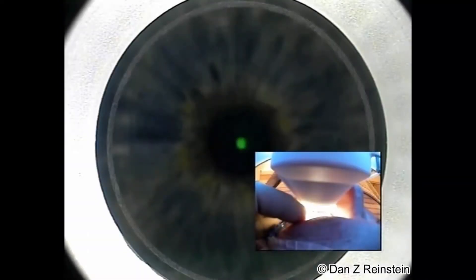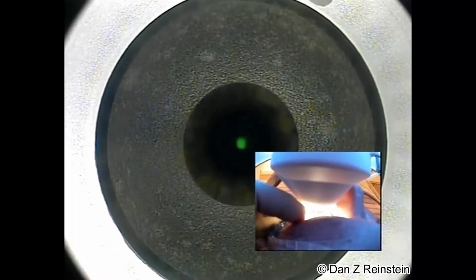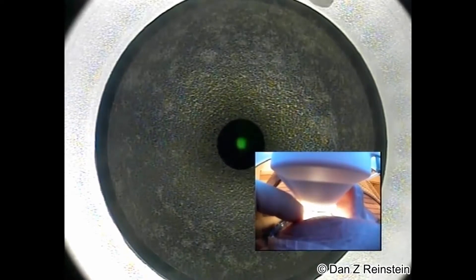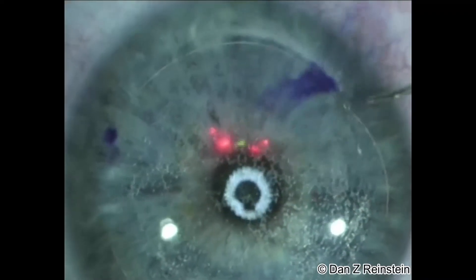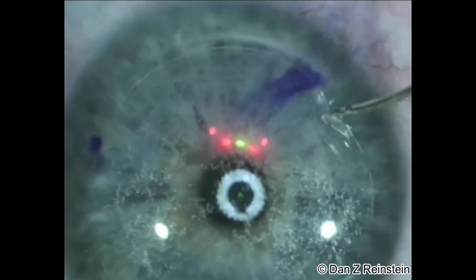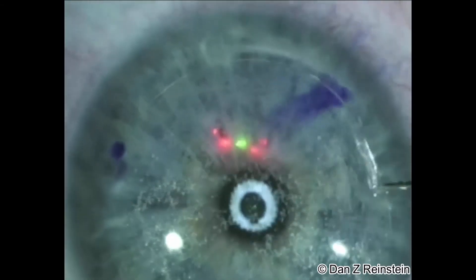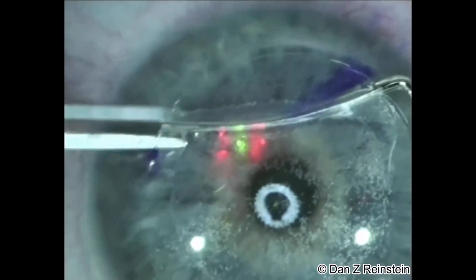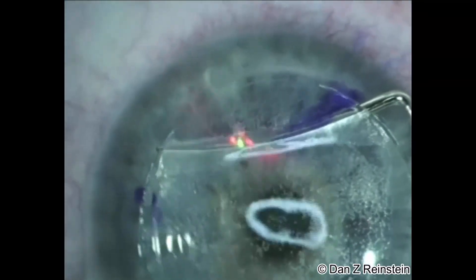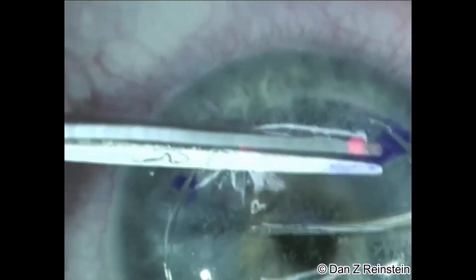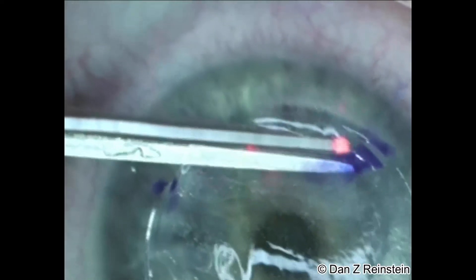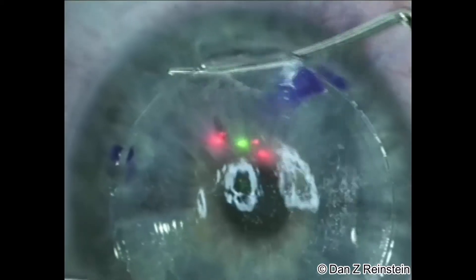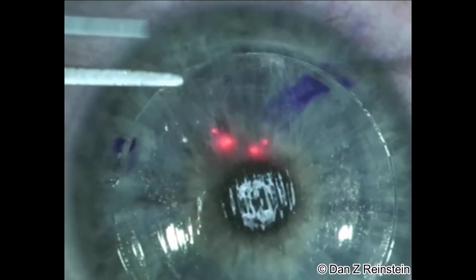Here's a video demonstrating the technique. We have the bubble pattern that looks pretty routine — obviously you're watching this like a hawk; you don't want to see anything odd on the bubble pattern. We score the side infratemporally, go across, punch through, and insert the second instrument. We use the pseudo-hinge to pull against as we're dissecting towards the hinge, and then finally we dissect the pseudo-hinge and lift the flap.